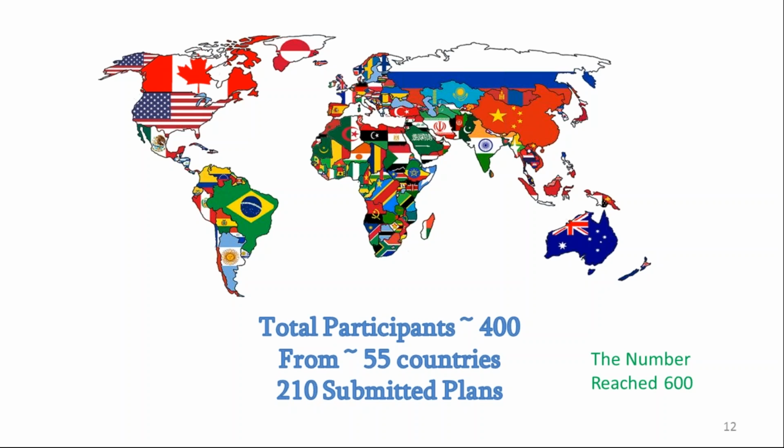We are very happy to tell you that the competition is enlarging more and more, especially after the IAEA agency accepted and requested from us all the details about our plan competition, and shared our website and our competition on their medical radiation physics main page.